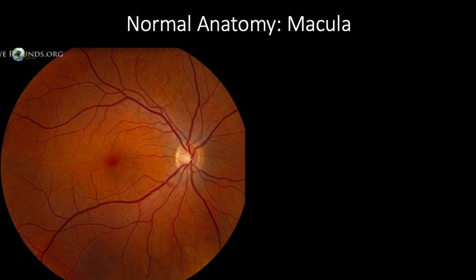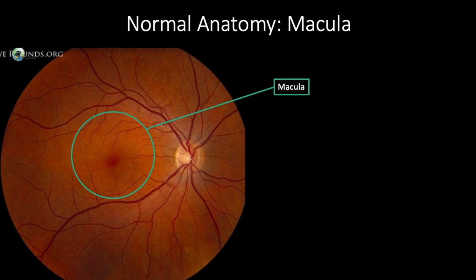The margins of the temporal vessels define our next area of interest: the macula. The macula is responsible for central, high-resolution color vision. Located in the center of the macula is the fovea, which is responsible for most of our visual acuity.